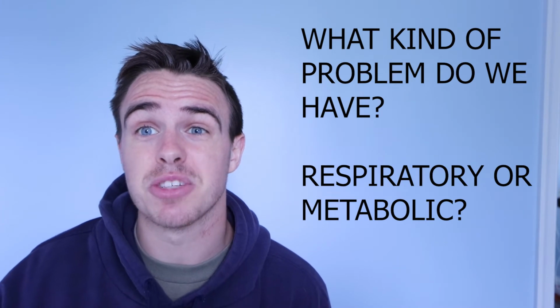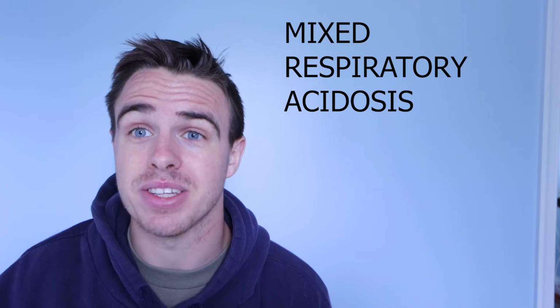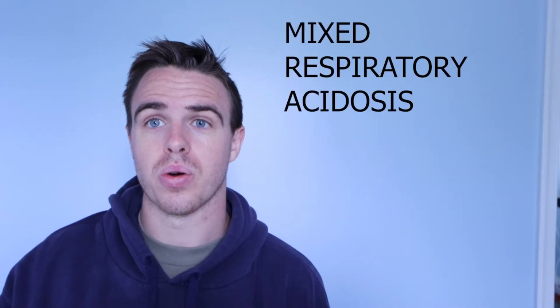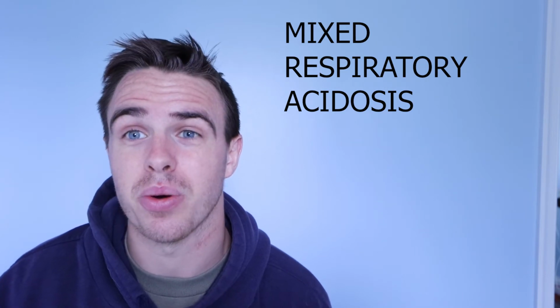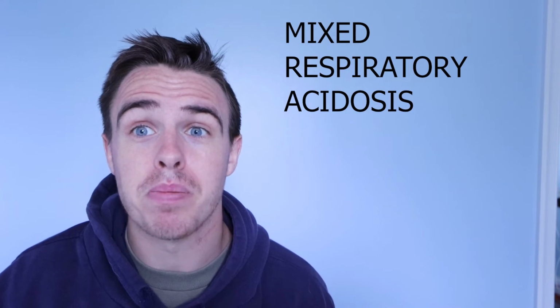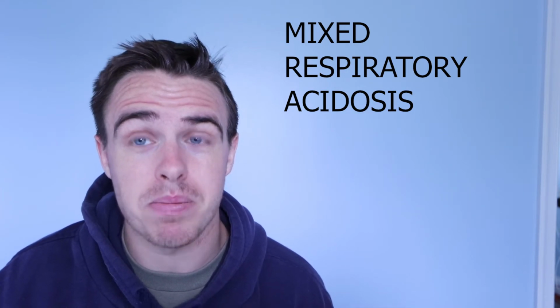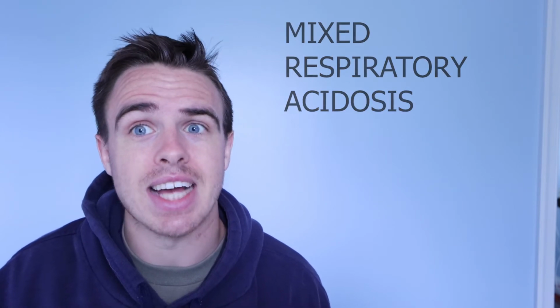So if you look at this, it would be a mixed respiratory and metabolic acidosis. Why is it mixed? It's mixed because the respiratory, or the CO2, is not normal, and the metabolic, or the bicarb, is not normal. Both are at the acidic level, bringing the pH down. So therefore it's a mixed acidosis.